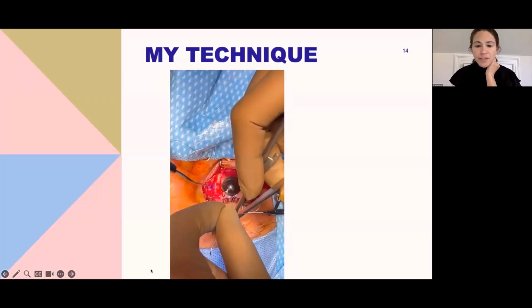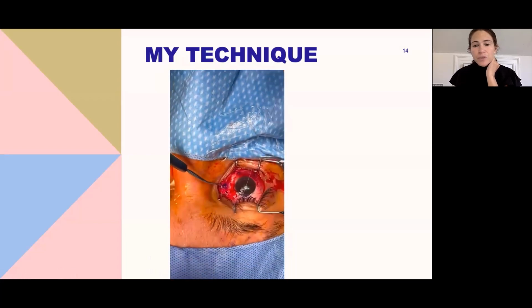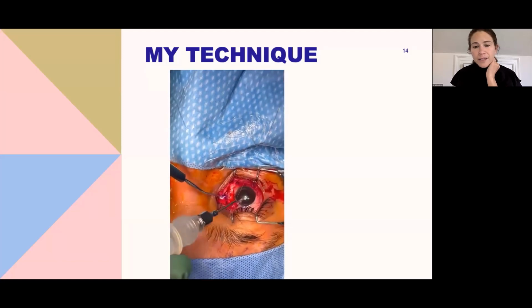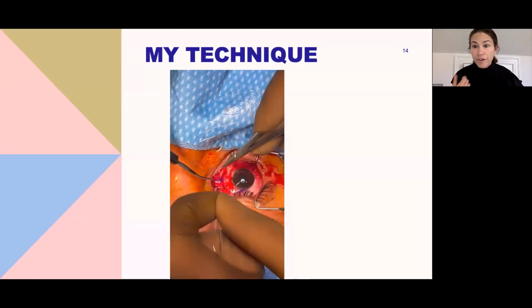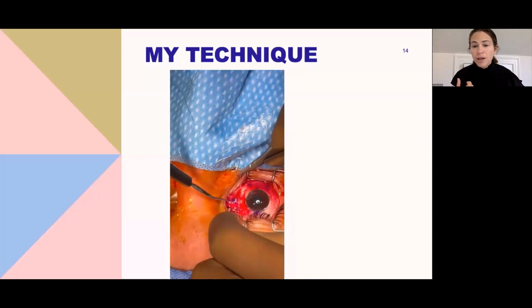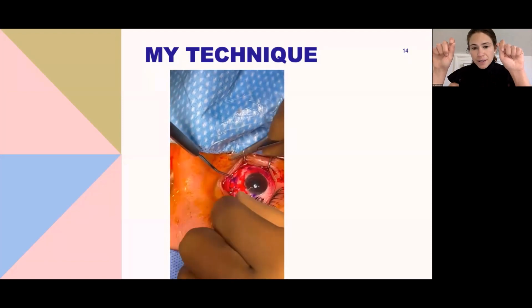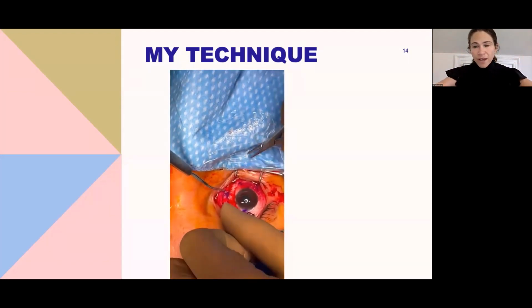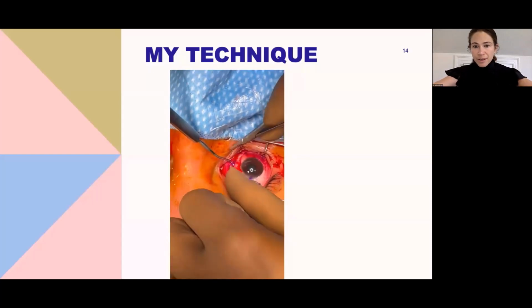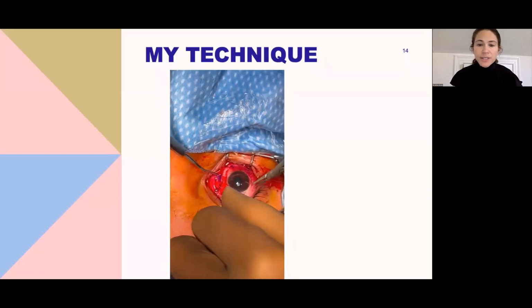And so in this video, we'll see that I'm tying this first as a 3-throw tie. I find the 3-throw very stable for my first throw. And then I pull up on the muscle to the ceiling and then in the plane of the eye toward the limbus for my second pull. And that folds the muscle. And you can see that happening now.